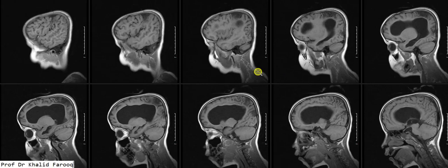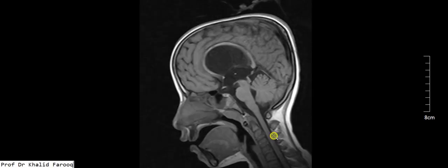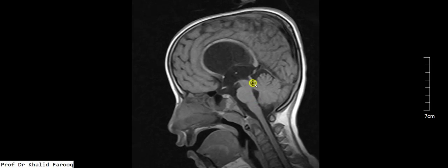Here we can see significantly dilated lateral ventricles and an area of gliotic changes because of old ischemic insult. On the sagittal view, there is a normal appearing fourth ventricle, but stenosis is noted in the lower portion of the cerebral aqueduct. We can see the third ventricle is dilated.